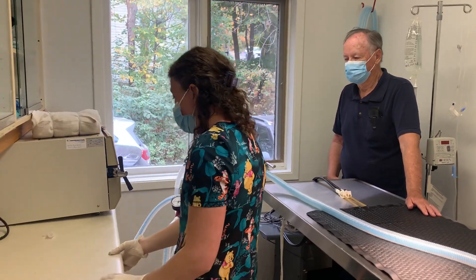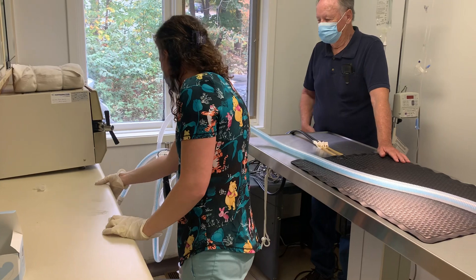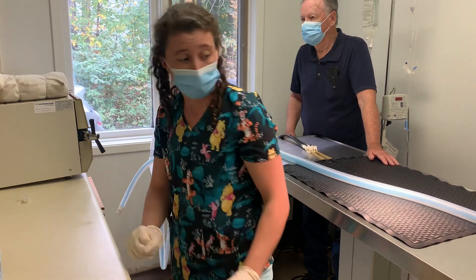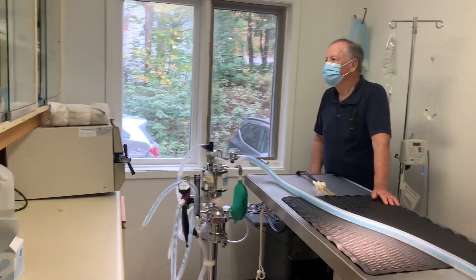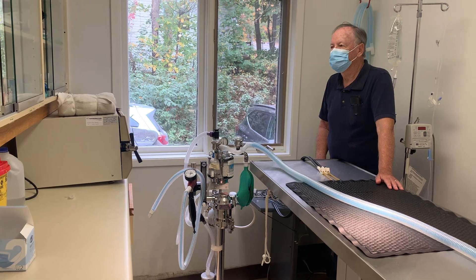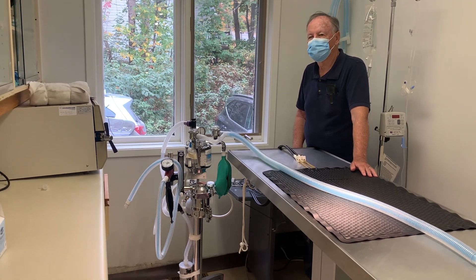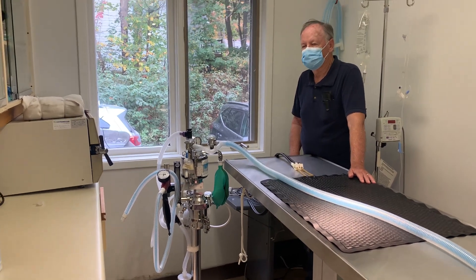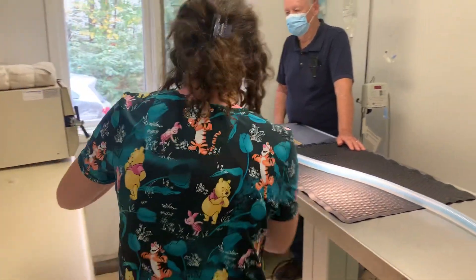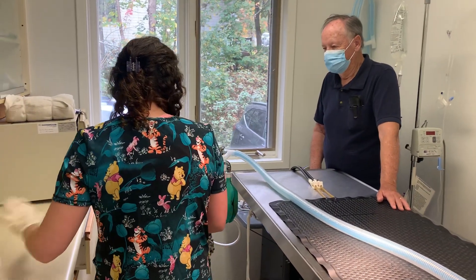Now I'll grab a piece of tape and I'm just going to write on it the expiry date.